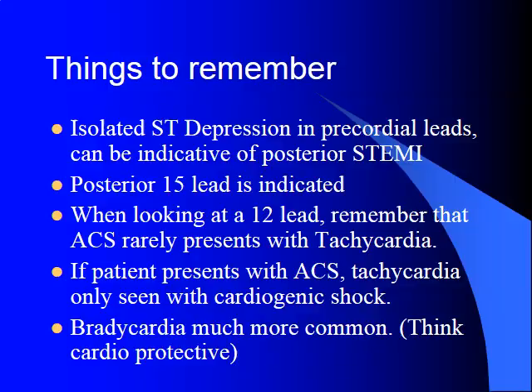We do need to remember that isolated ST depression in our precordial leads can be indicative of posterior STEMI. ST depression is generally a sign of ischemia, as well as T-wave inversion.